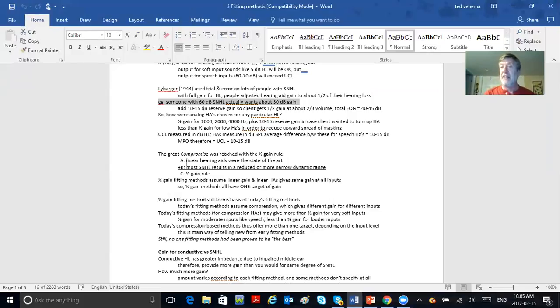So he would give that guy a hearing aid. If the guy had a 60 dB flat hearing loss, he would give the guy a linear hearing aid that had a maximum gain of about 45. 30 to accommodate half gain, and the extra 15 for reserve gain in case the grandkid came in and was speaking softly and the guy wanted to crank it up a bit. Cool? All right.